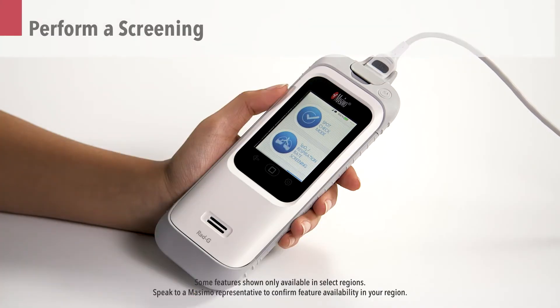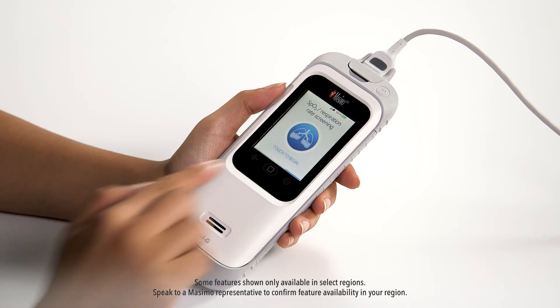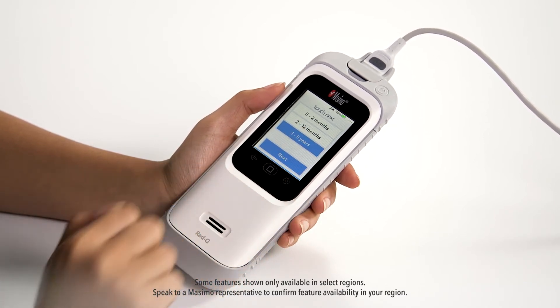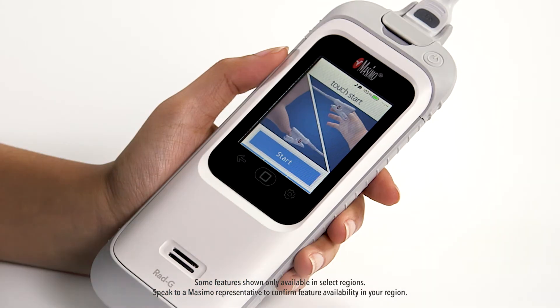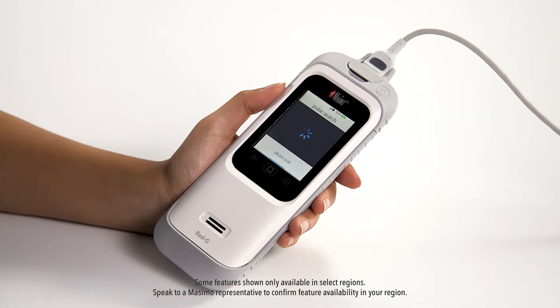To perform an SpO2 and respiration rate screening, select SpO2 respiration rate screening from the mode selection screen. Select the age of the patient from the list provided on the screen by touching the appropriate age category: 0 to 2 months, 2 to 12 months, or 1 to 5 years. Then press the next icon. Once the sensor has been properly applied, touch start to begin the screening. RadG will begin searching for a pulse and the display will change to a measuring screen with animation and a song to help distract the child.